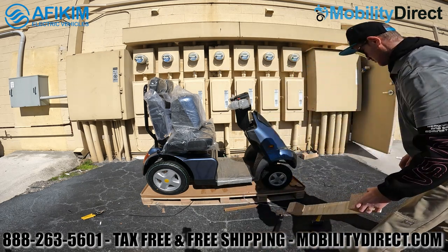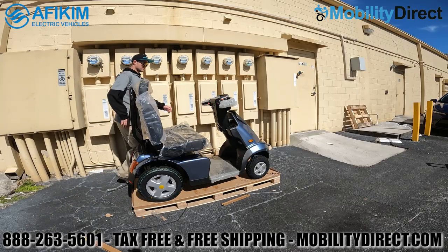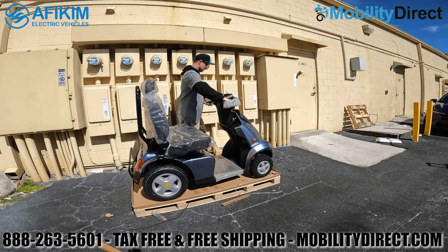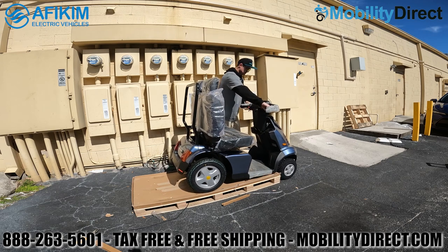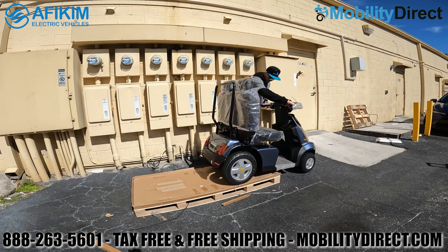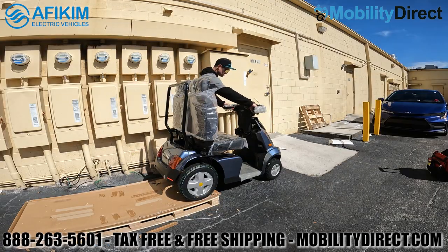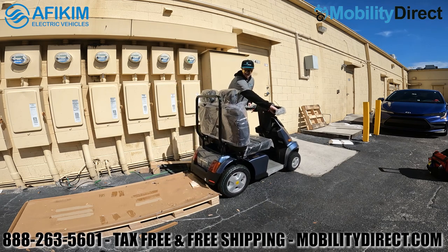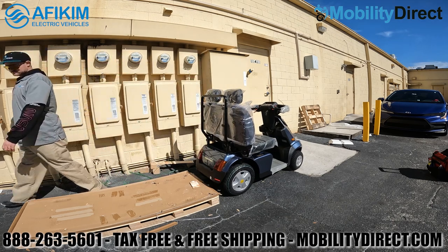Once the blocks are removed, you can literally roll the scooter right off the pallet, or turn it on and use the motor to scoot it forward carefully so it doesn't jump off too abruptly. The scooter has plenty of ground clearance so it won't get caught on the pallet on the way down. We're then clearing the pallet to make room and continue with the assembly process.